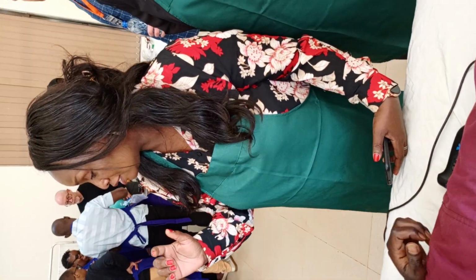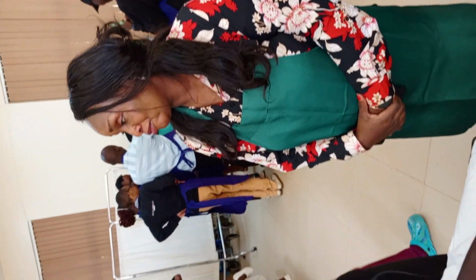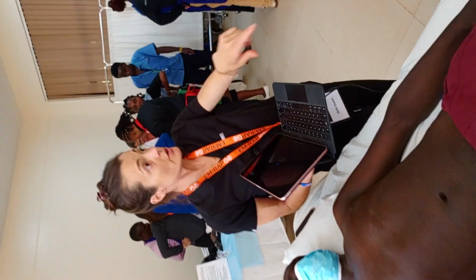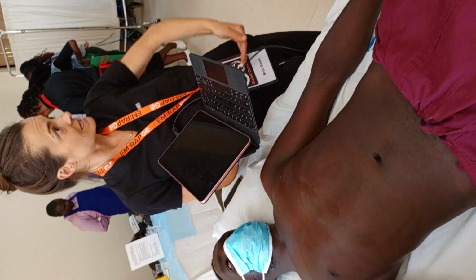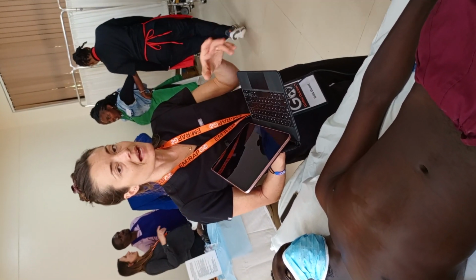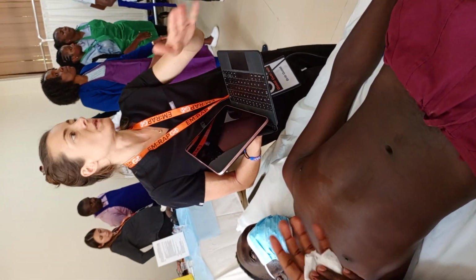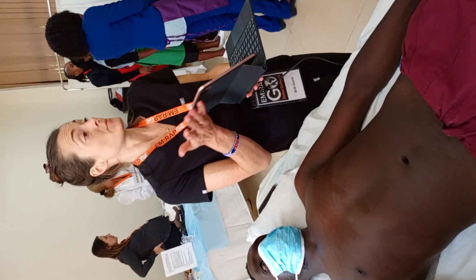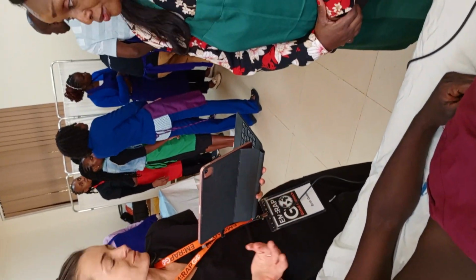Do you usually look at the distinction between blood and excess fluid? When you look at the bladder, what you see inside that we know is urine is exactly what blood looks like, exactly what someone with ascites looks like. If you look in the eye, it's exactly what aqueous humor looks like. So you can't tell by looking at it what type of fluid it is, but in the setting of a trauma, it's blood. Sometimes you have someone with liver cirrhosis in a trauma. Is it a positive FAST, or is that just their ascites? We wouldn't be able to tell.